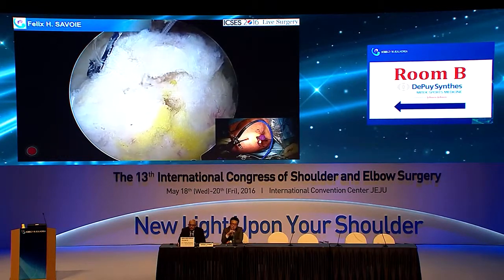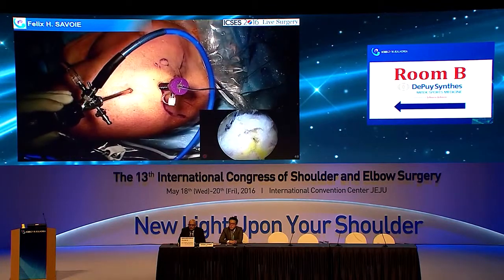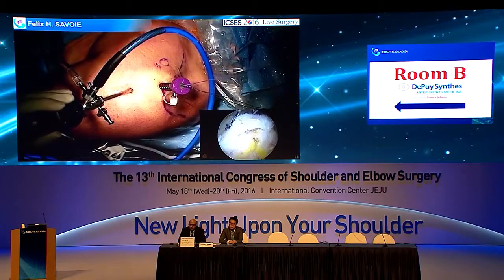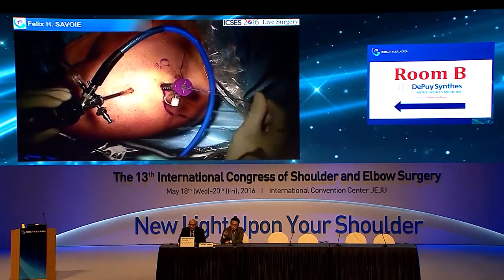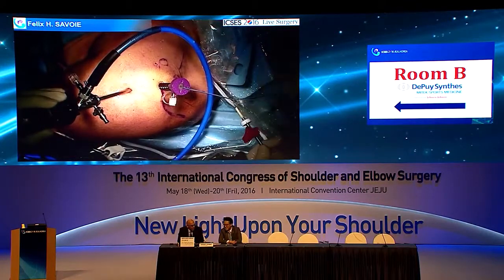Can you show us outside? Outside view, please. 1, 2. So this is a helix. And this is a helix knotless to recreate our footprint. Can you arrange the camera angle? And a short one. Yeah, JC, I can't say that, so I'm glad you're up here.